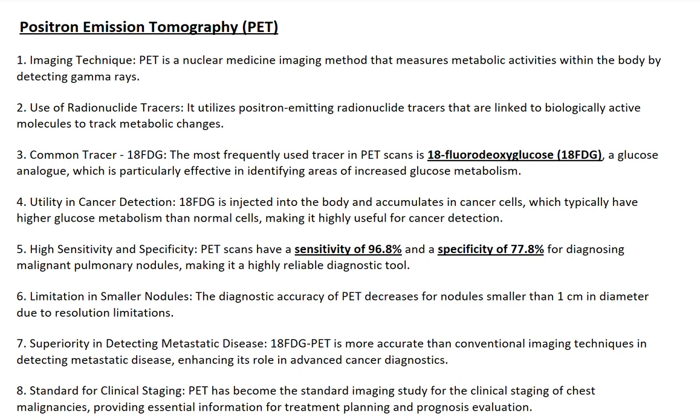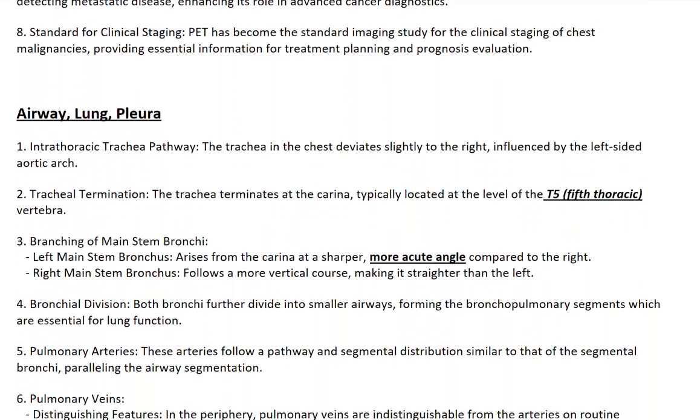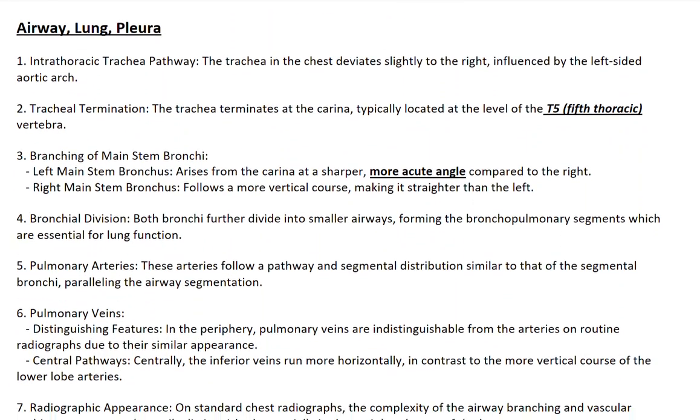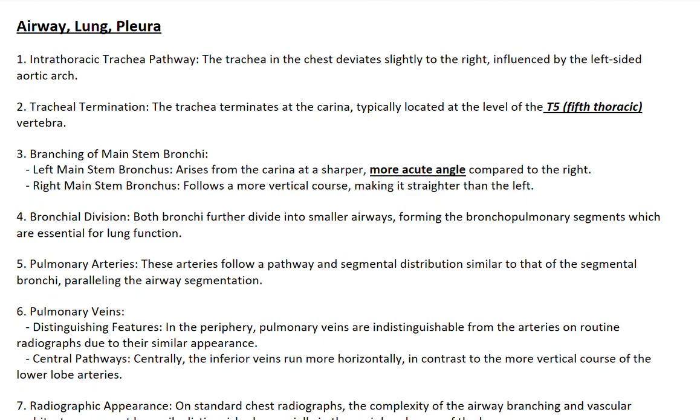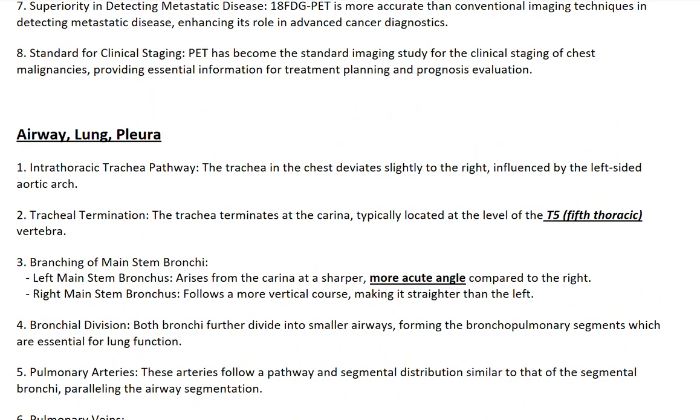8. Standard for clinical staging. PET has become the standard imaging study for the clinical staging of chest malignancies, providing essential information for treatment planning and prognosis evaluation. PET scans are a crucial tool in modern medical diagnostics, particularly for identifying and staging cancer, due to their ability to visualize metabolic processes at the cellular level.